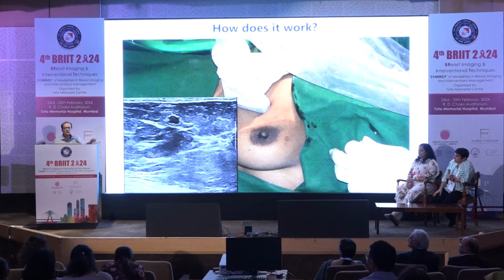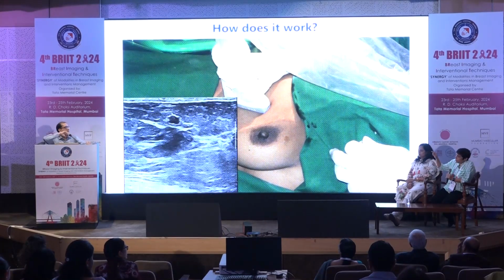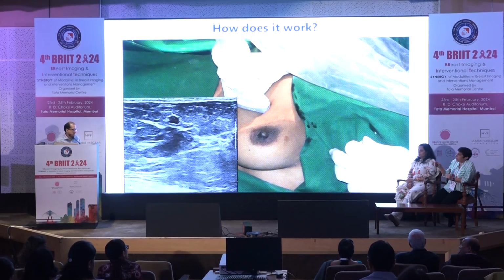And if you look at the ultrasound image, there are some microlobulations. The point here which I wanted to bring is that if you see a lesion like this, definitely it has to be biopsied if you are thinking of excision. Anyways, you did CEM and the patient didn't want it, so it makes sense to go ahead and do an excision.